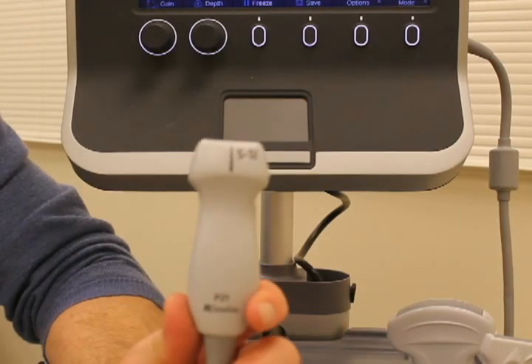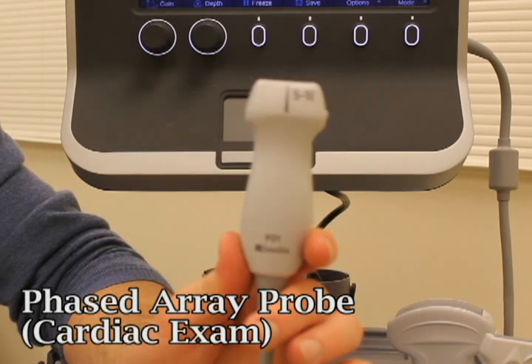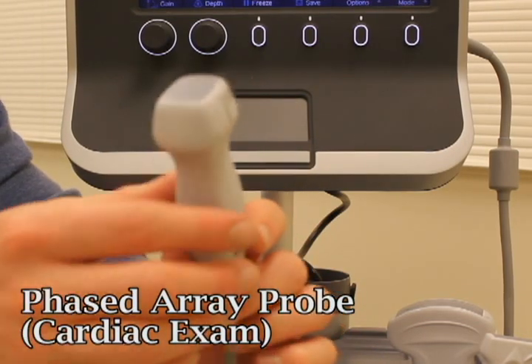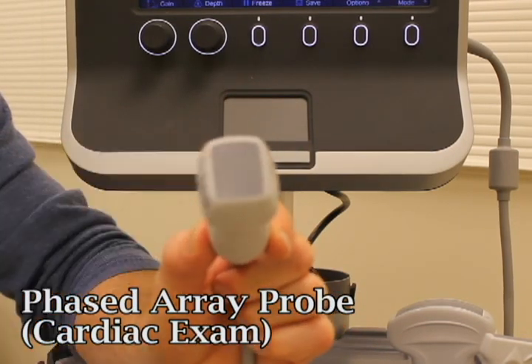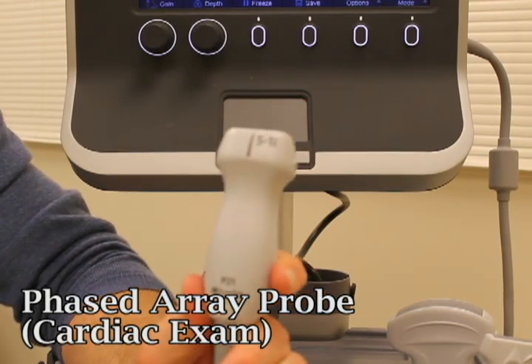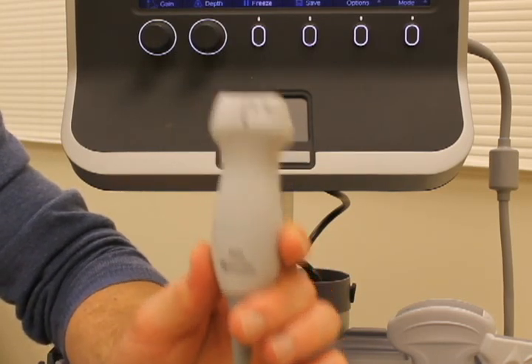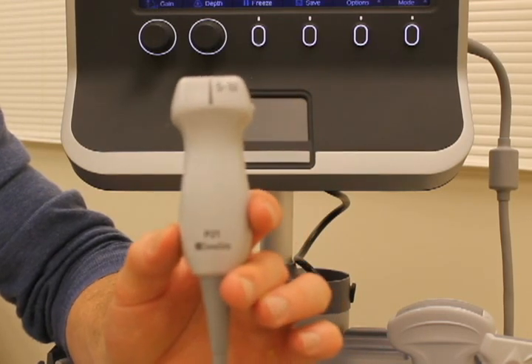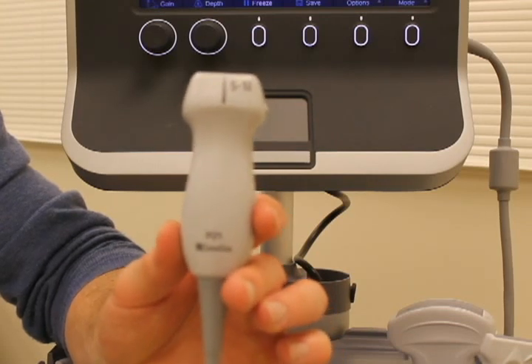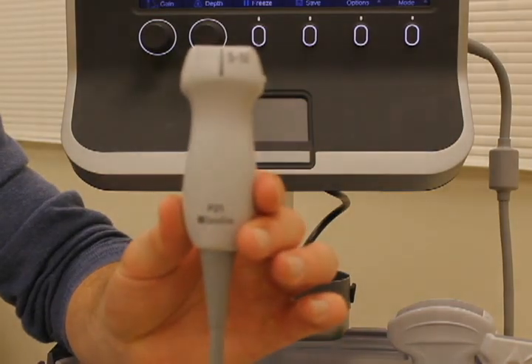The last probe we use in internal medicine is the phased array probe, also referred to as the cardiac probe. It's really good at doing echocardiography because it has a small footprint, which allows the ultrasound beam to effectively go between the ribs and give you a view of the heart without any rib shadow. You can also look into the abdomen with it, though it gives you a smaller field than the curvilinear probe. It's also excellent for assessing the size of pleural effusions, since you can look between the ribs.